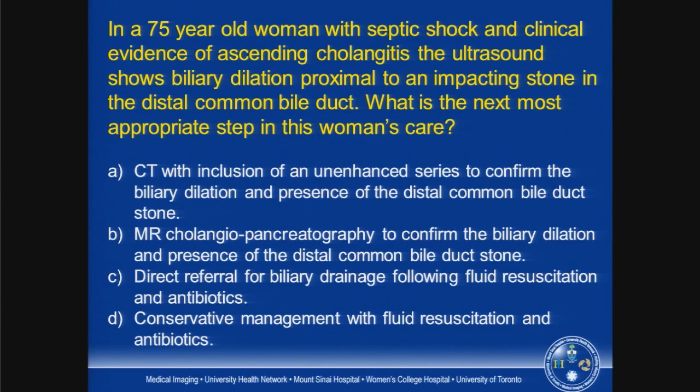Should she have a CT with inclusion of an unenhanced series to confirm the dilation and the presence of the distal common bile duct stone? Should she have an MRCP to confirm the biliary dilation and the presence of the distal common bile duct stone? Should she have a direct referral for biliary drainage following fluid resuscitation and antibiotics? Or should she have conservative management with fluid resuscitation and antibiotics?